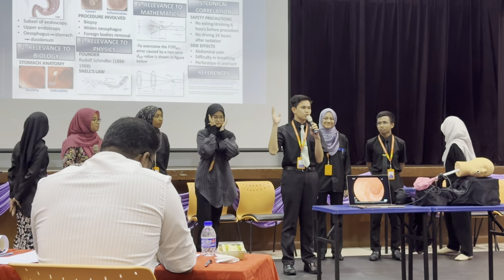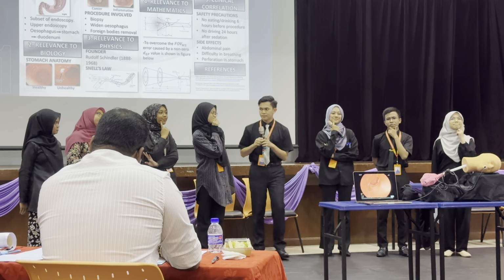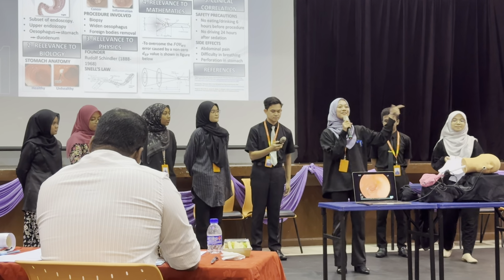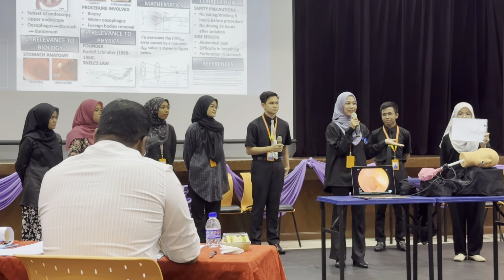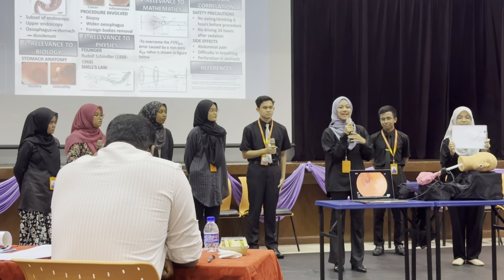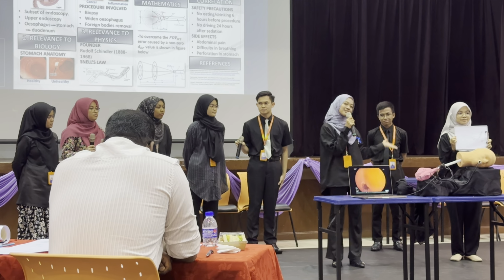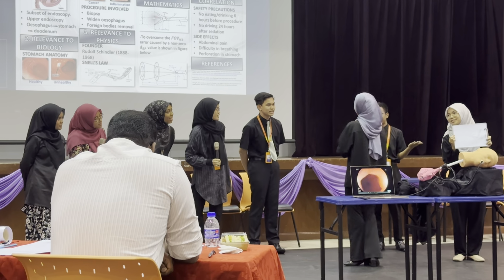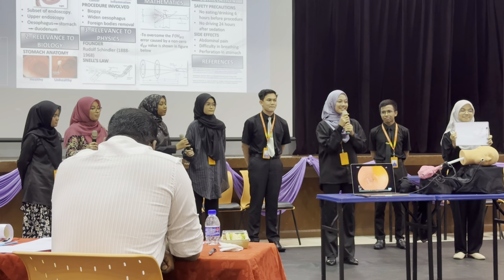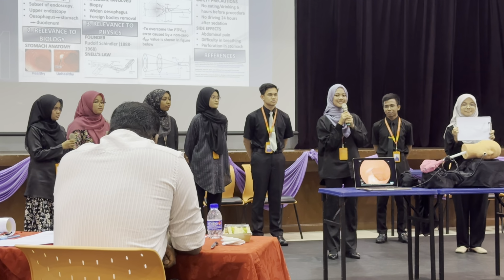I wonder who was the founder of gastroscopy and how he got the idea for this. I know. His honorable name is Rudolf Schindler. He got the idea to apply Snell's law, or the law of refraction, inside the gastroscopy technique. The refraction occurs between the outer fibers and inner fiber with the help of the telescope. The latest developments of gastroscopy are the capsule endoscope and AI assistance.